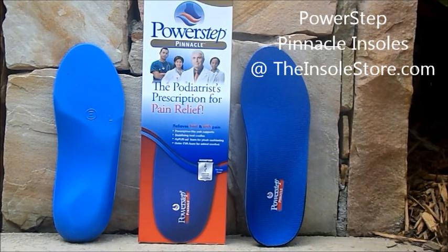Pinnacle's permanent anti-microbial top fabric coat combats foot odor and helps keep your feet dryer. The PowerStep Pinnacle's relieve heel and arch pain, provide prescription-like arch supports, stabilize the heel cradle, and are APMA accepted.